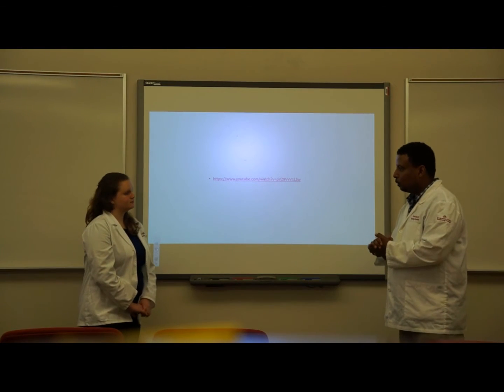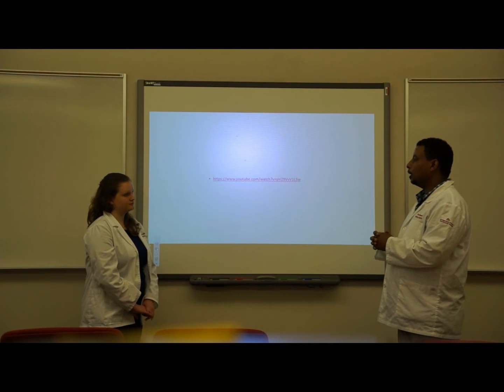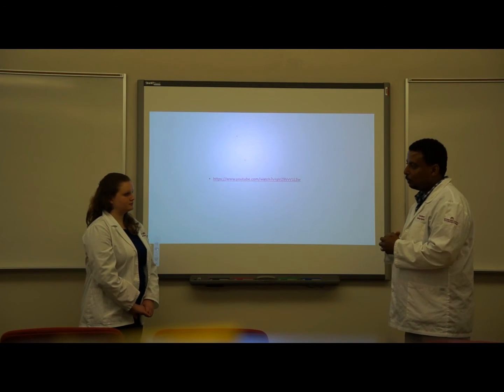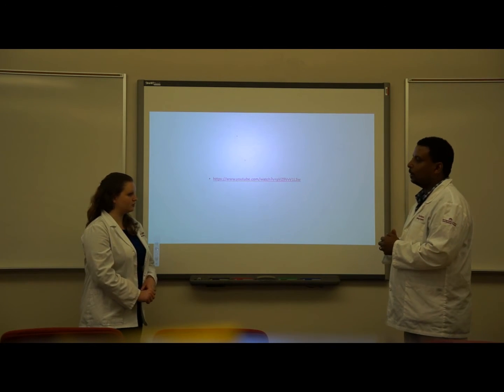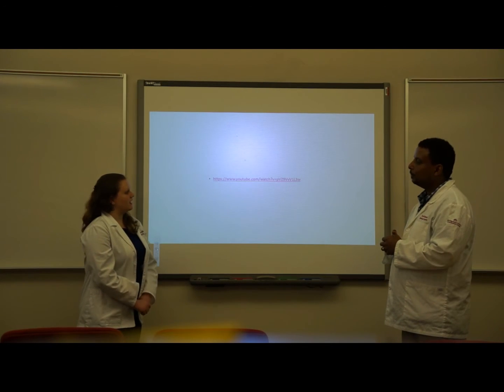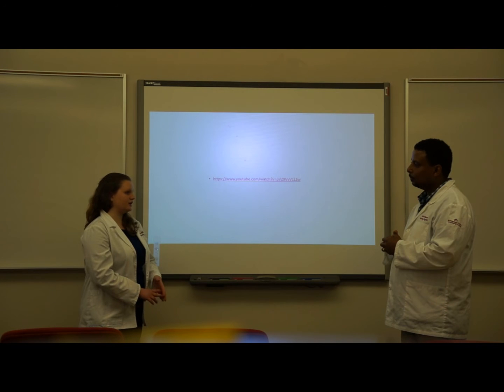So we covered complications and some care associated with Lvads. So can you tell me a couple of complications? Well, you can have a low pump flow, which is less than 2.2 liters per minute. You could have hemorrhage related to the cardiac surgery, related to anticoagulant or antiplatelet therapy.